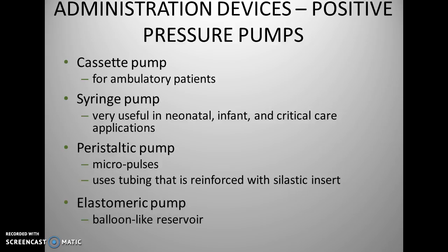And then you have something that's called the elastomeric reservoir or pump, and these are tennis ball sized pumps with a balloon-like reservoir surrounded by a rigid protective outer shell. And so these particular pumps have a reservoir that's filled with a solution, and this solution exerts a constant positive pressure, and this forces the fluids through the tubing into the patient.